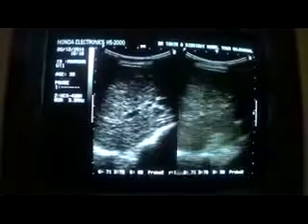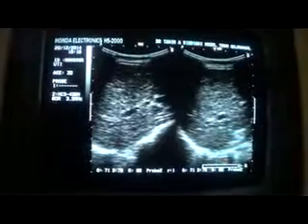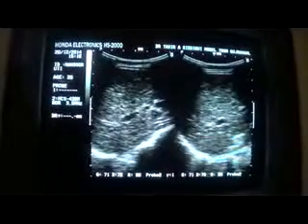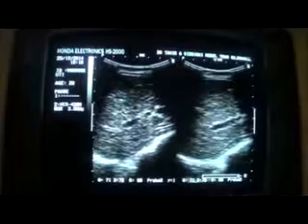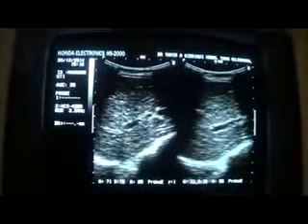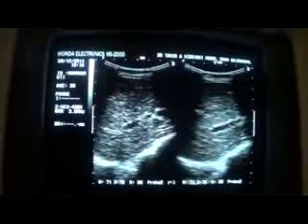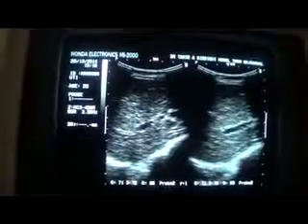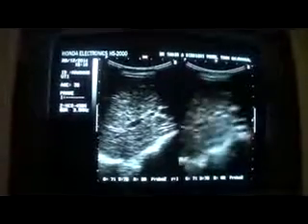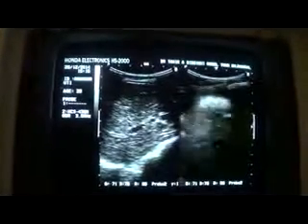and the diaphragm appears more thick as compared to the normal. This diaphragm is thicker than as we see in normal cases. This is the posterior branch from the right portal vein. See the echogenic border around it. It is increased. So there is increased echogenicity of the periportal echoes.